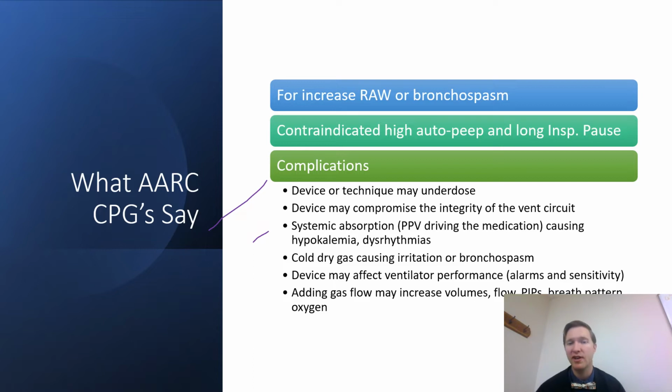Systemic absorption causing hypokalemia and dysrhythmias could be a potential with this, because the positive pressure ventilation is driving the medication. In theory, we have more inertial impaction as the medication is getting forced and delivered there.